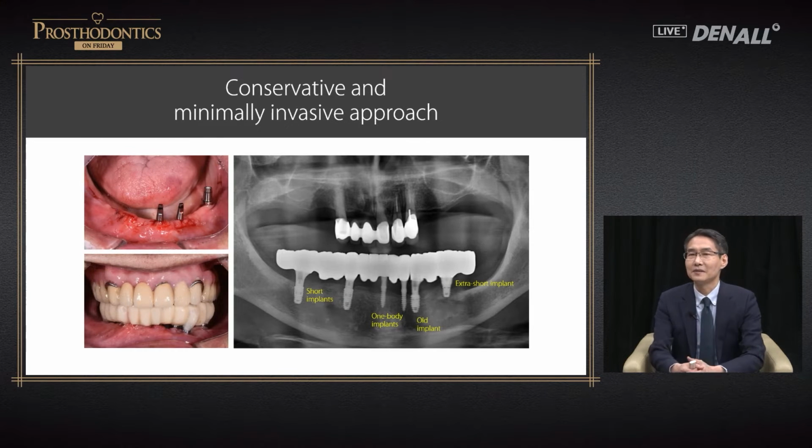The previous case had one-body mini implants, but you can see that there are many different implants here.